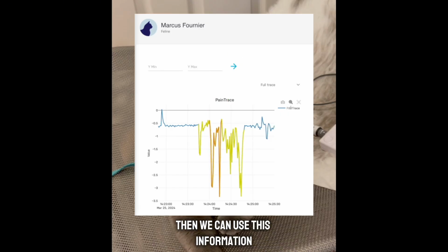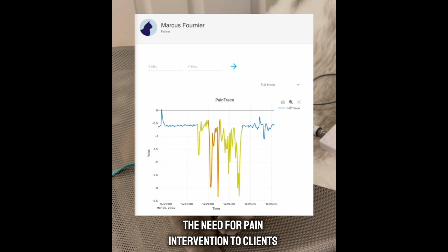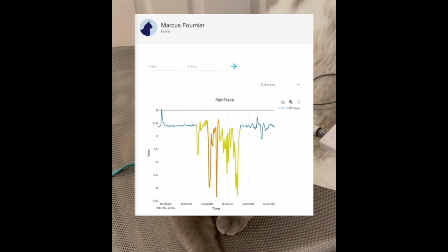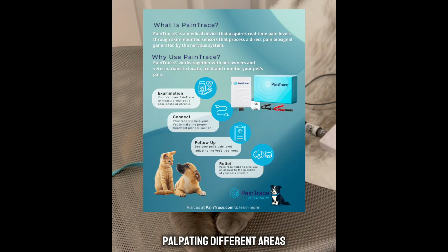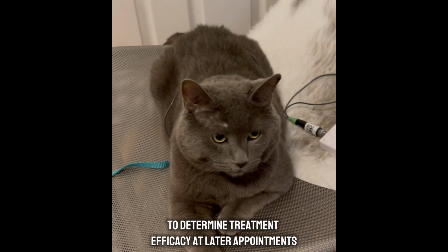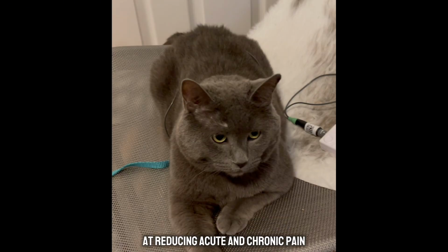Then we can use this information to communicate the need for pain intervention to the client, essentially providing a voice to the animal's pain. We can also use it to guide further diagnostics and imaging because of its ability to locate the pain as you're palpating different areas. And it can also act as a baseline of pain to determine treatment efficacy at later appointments. And this is really important for determining whether or not a treatment is truly effective at reducing acute and chronic pain.